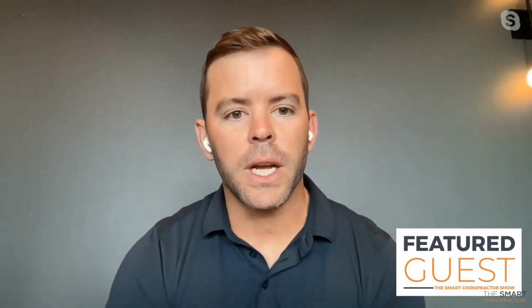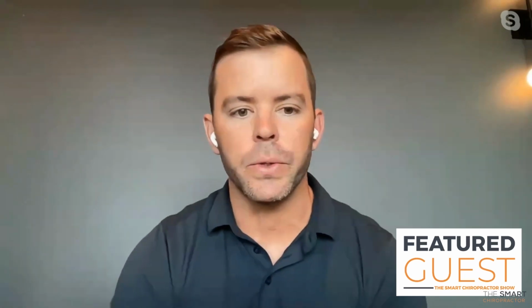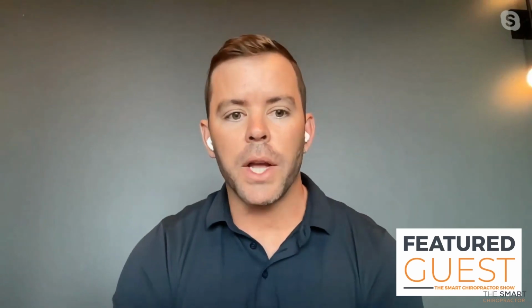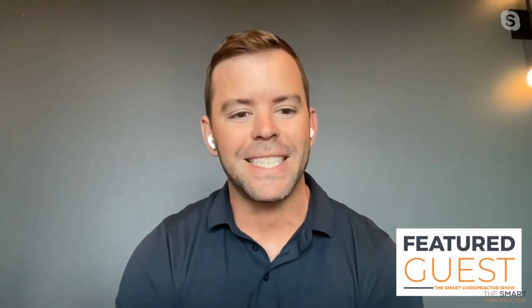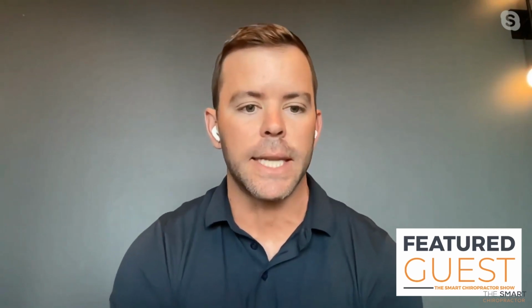Yeah, it's a great question, Jason. We have practitioners that will use it really on a case-by-case basis, right? A lot of our practitioners will utilize this to supplement their flexion extension X-ray. Depending on the provider type, some might take a flexion extension on every patient. If they see any type of instability and any unstable challenge that might be there, they'll order a VMA at that time. For those providers that may not have X-ray in-house, or choose to utilize the VMA for every flexion extension film, we have those as well.